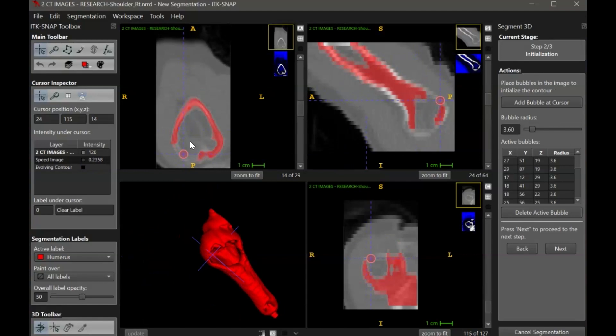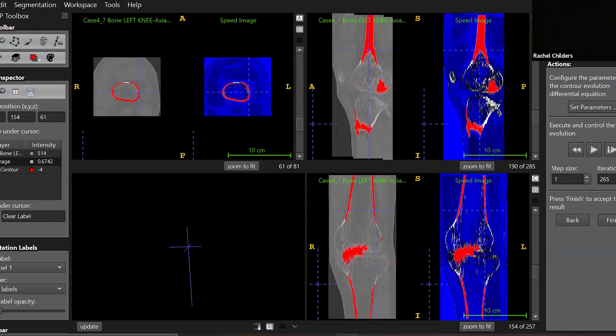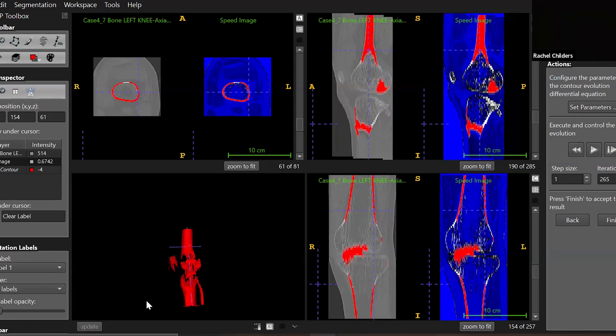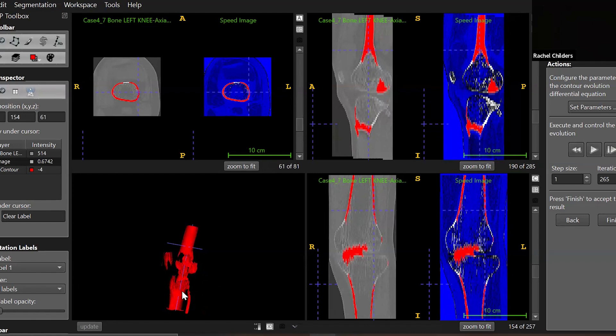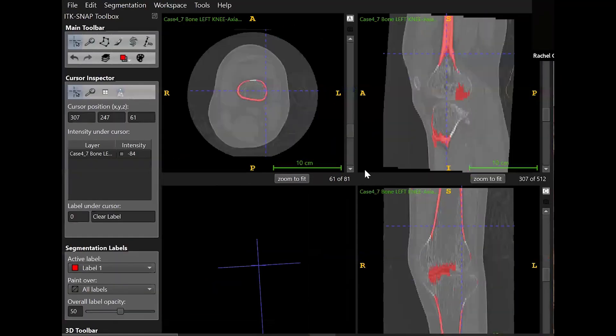If you're using ITK-SNAP on a laptop or another computer with limited processing power, I don't recommend using the back button between step 2 and 3, because we've found that this can cause high likelihood of the software to crash or stop responding. Instead, if you need to increase the area of your segmentation, you can click the finish button.